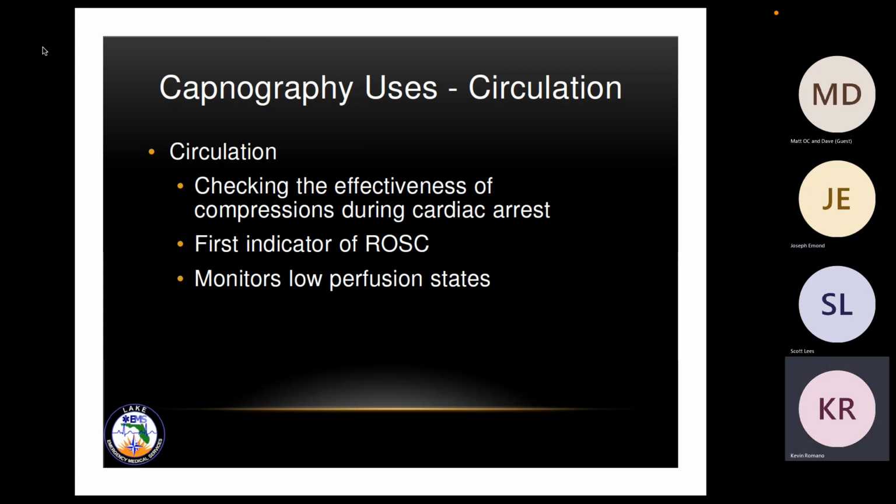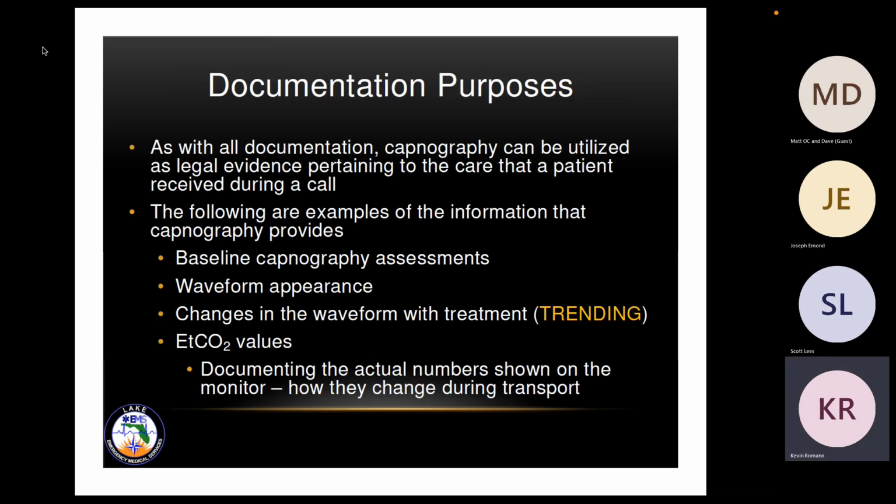Other things to pay attention to as well. If a patient has overdosed on antacids and you intubate them and it goes in their esophagus and you miss the tube, you may get end tidal readings from that antacid off-gassing. That's one of those rare things, but just keep that in mind too. The best way to make sure you're definitely in is visualization through the cords and good end tidal. Make sure you get that good visualization as well. That's why glide scopes, video scopes I should say, are hands down one of the best devices ever for managing airways.